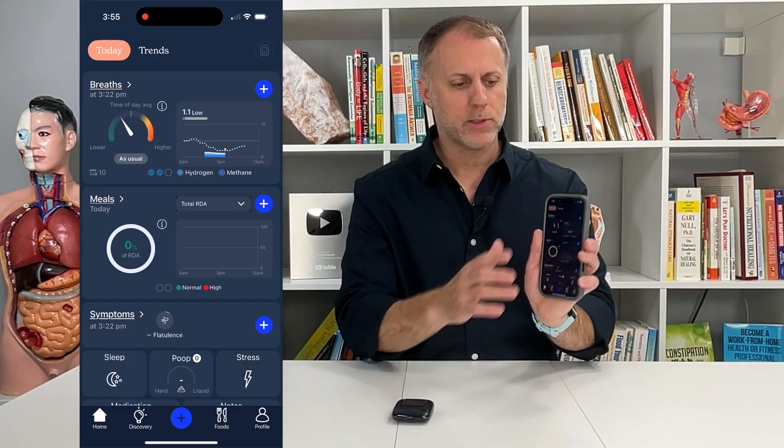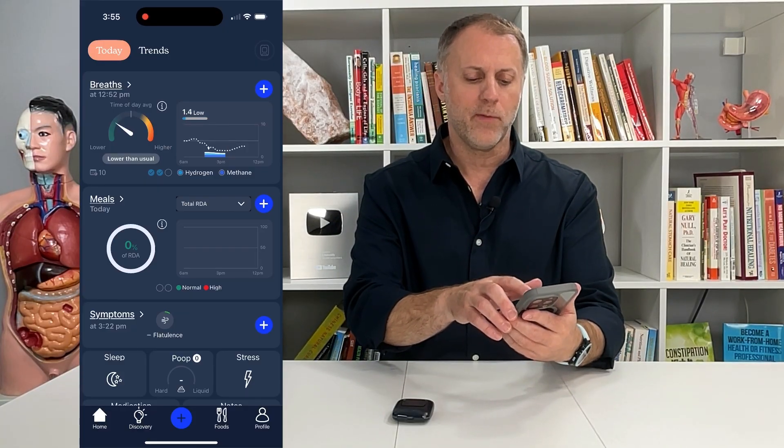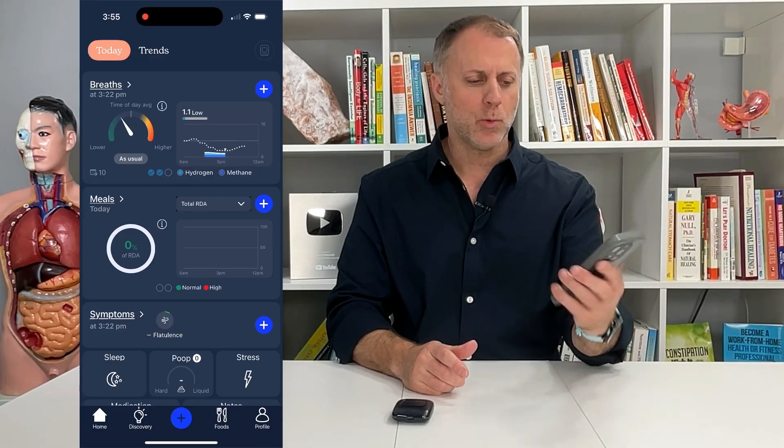It's nice to have that all together. You can see here that I did the test already and I had a 1.4 earlier today and a 1.1, and that's really what you want.